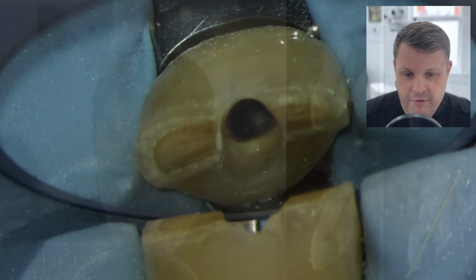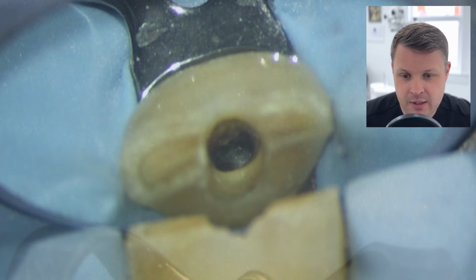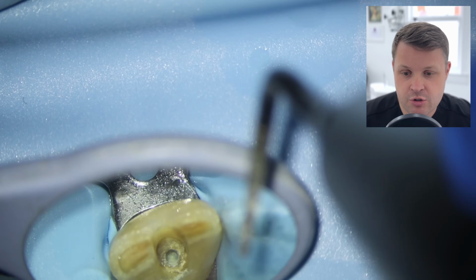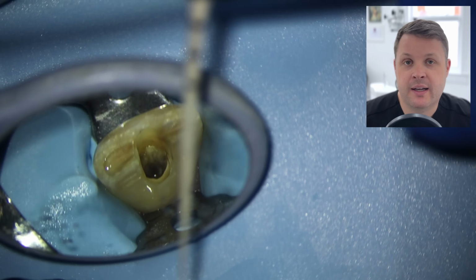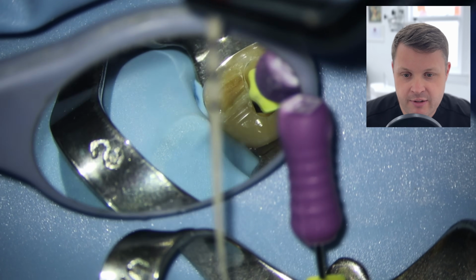So we know the tooth's perforated, and like I say, once we opened up the tooth initially, maybe I can see an orifice here slightly buccally. I know now that I've got more orientation with this second cone beam CT scan, so I'm just going to use the diamond-tipped ultrasonics to reorientate. Obviously this creates water within the canal orifice, so I can't see down there, so I'm going to use a paper point just to have a little feel around, and straight away I find the canal orifice. It just takes that kind of orientation.